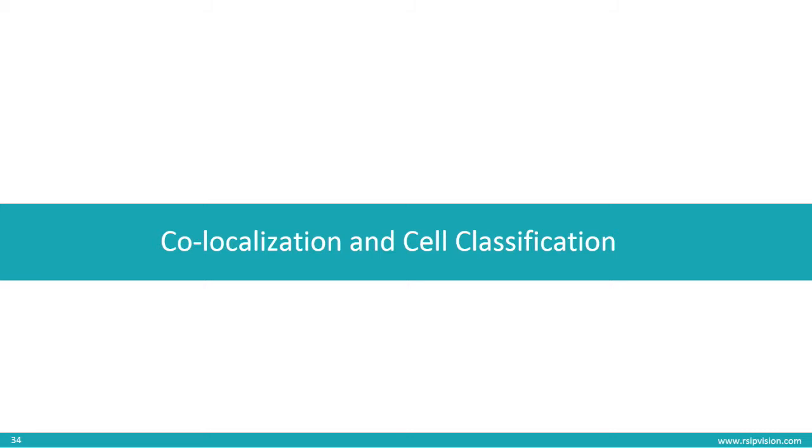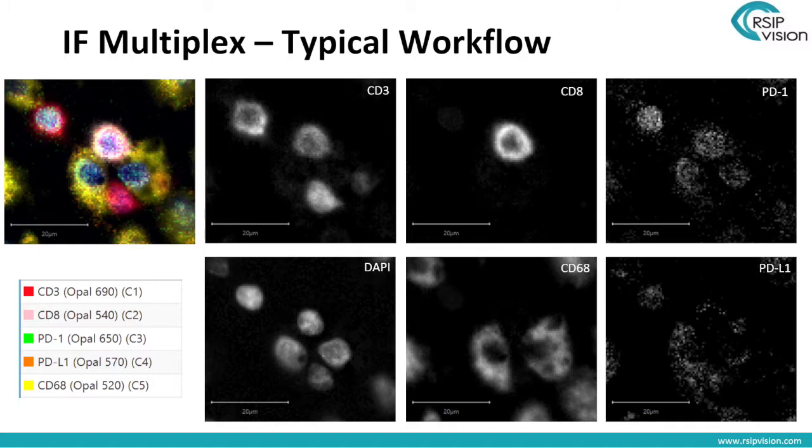Or what's called in this profession, colocalization. So this is a multiplex image, which means we have multiple dyes that are fluorescing in different wavelengths. These are captured. It comes to our algorithm as an image with multiple channels. The colorful image is just a way of displaying it. And typically, the way these cells are classified, you have a pathologist who knows what they're looking at. They know what they're looking for. They can explain it. They can train an annotation team to reasonably annotate this.